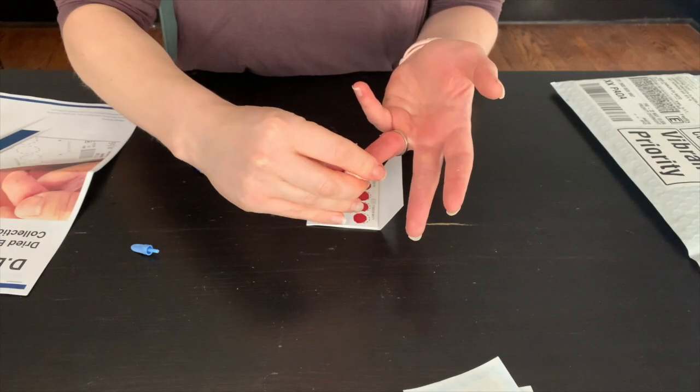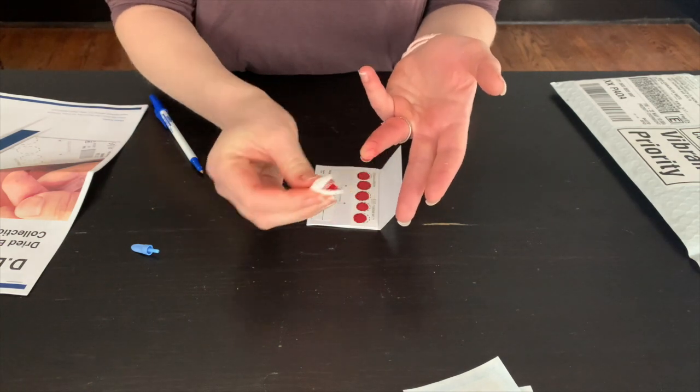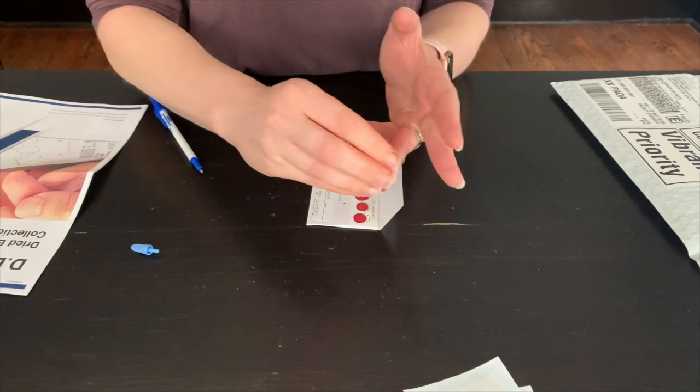Once you have filled all of the circles on the specimen collection card, use your gauze pad to wipe away any remaining blood from your finger. Apply pressure to it and then apply the bandage.